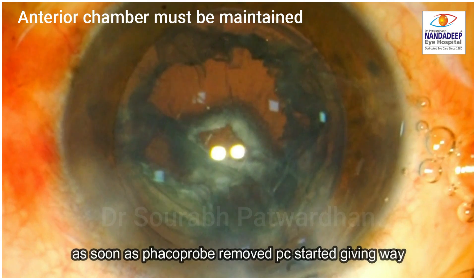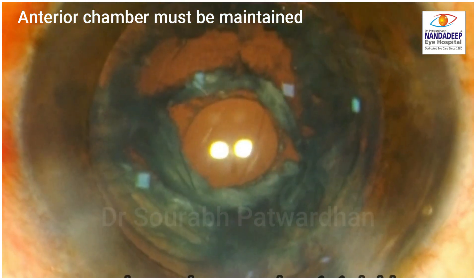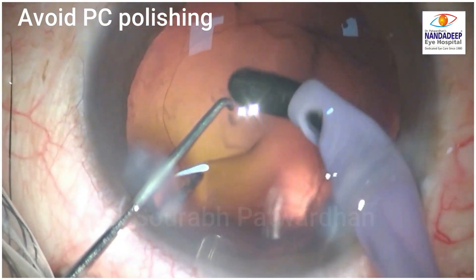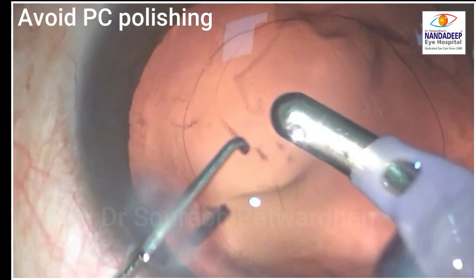The anterior chamber must always be maintained — any collapse of the anterior chamber may lead to opening of the posterior capsule and loss of vitreous. PC polishing should be avoided as the posterior capsule is already fragile and there might already be an opening in it.